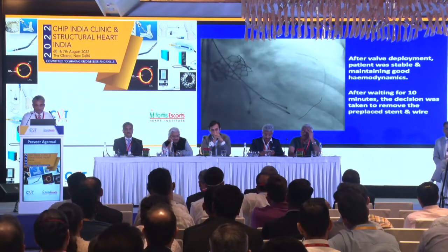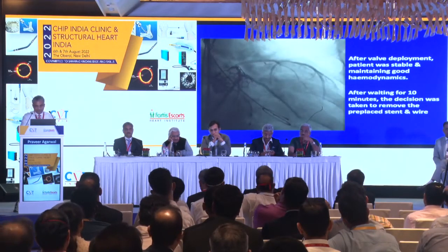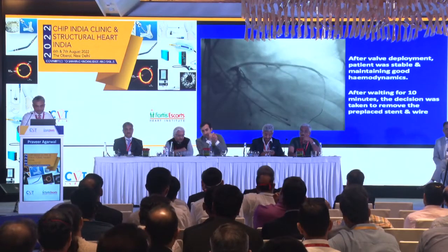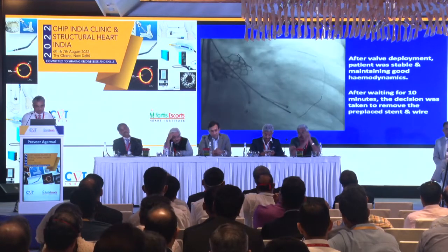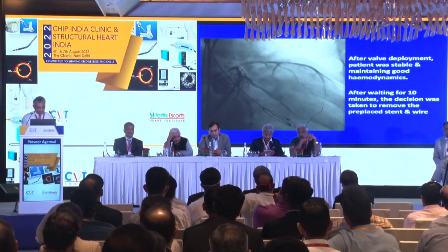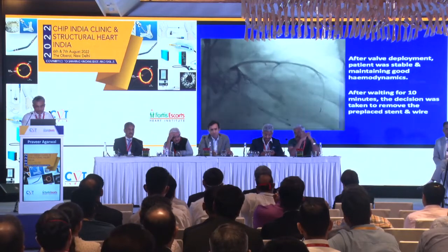After deployment the patient was stable, so they said, why can't we wait a few minutes more and then see? And after about 10 minutes or so, they decided that we should just remove this stent and not deploy it. Once you are operating outside, you don't have everything in your hand. You're just there at times to assist them. So they said okay, fine, you can take it out. And that was a disaster.